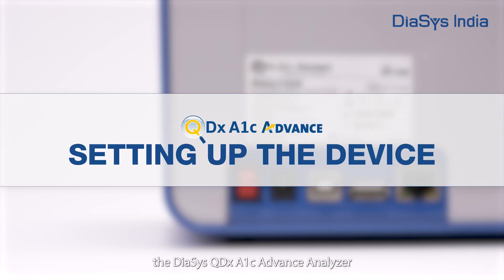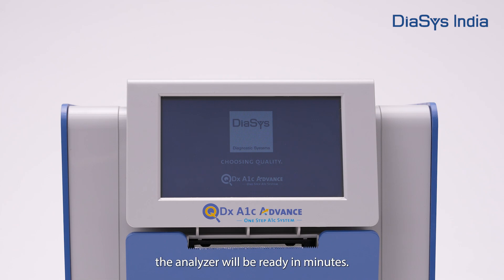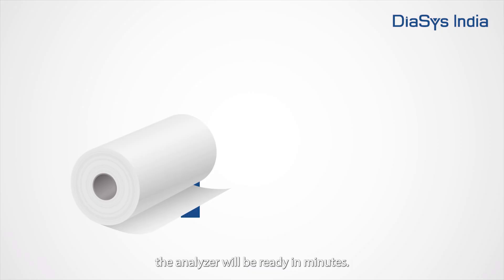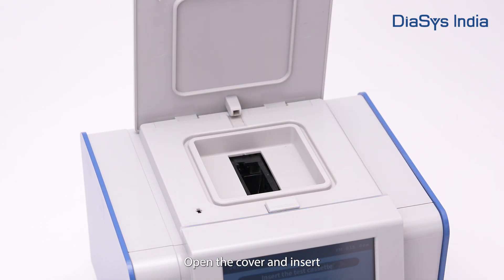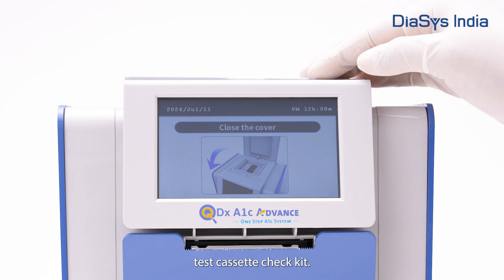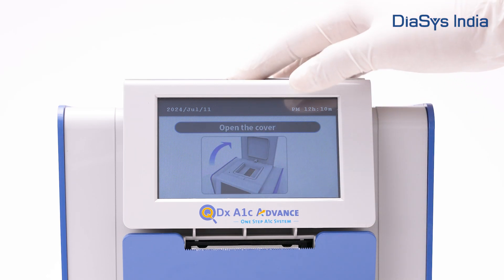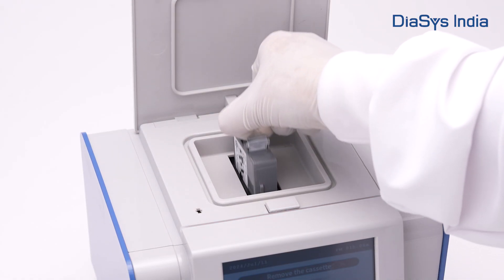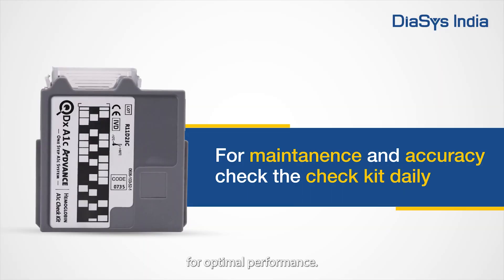Setting up the DiaSys QDx A1c Advance Analyzer. Plug in the power cord and press the power button. The analyzer will be ready in minutes. Place the printer paper roll facing upward. Open the cover and insert the auto-calibrated individual test cassette check kit. Close the cover and wait for the results for about a minute. To confirm success, press OK and remove the check kit. Remember to check the kit daily for optimal performance.